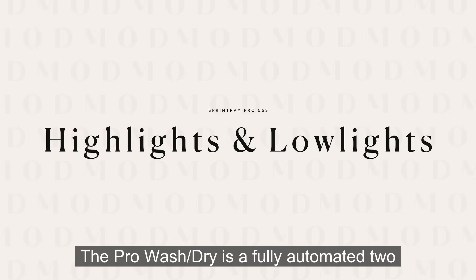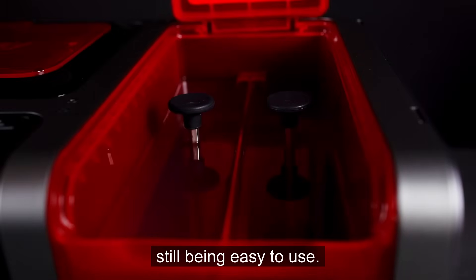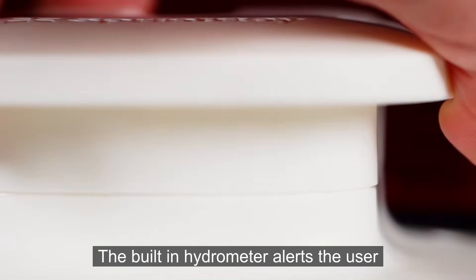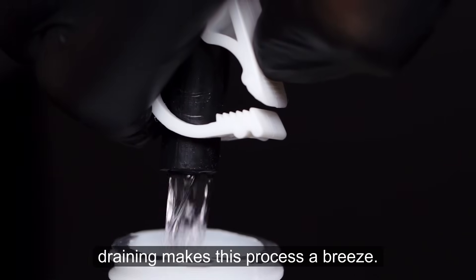The Pro Wash Dry is a fully automated two-stage wash and dry system built to deliver speed and cleanliness while still being easy to use. It uses mechanical jetting to rapidly deliver IPA to the printed parts. This unique method provides excellent agitation, reducing wash duration, making it one of the fastest wash units available. The built-in hydrometer alerts the user when there's a need to replace the alcohol, and the touch-free draining makes this process a breeze.